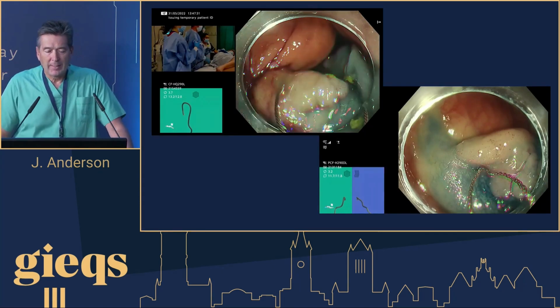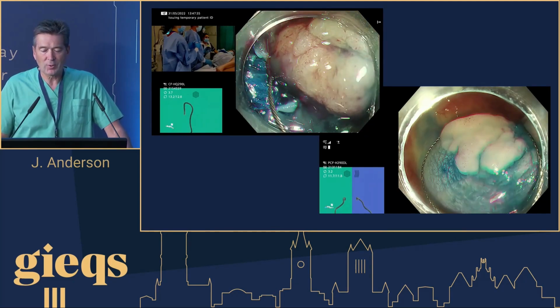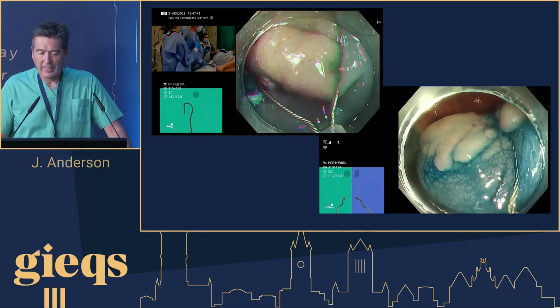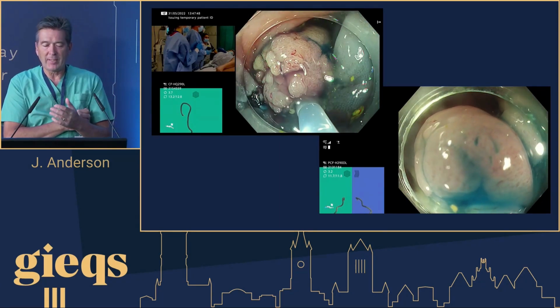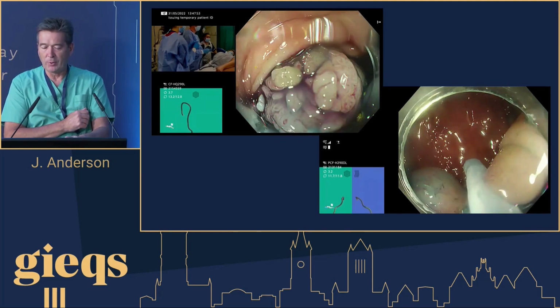And here's just a couple of examples of this. We want to be nice and close. We want a cuff of normal tissue. We push down. And after we close the snare, having pushed down to get the snare down, you're going to lift the tip up ever so slightly to make sure that the snare is in alignment with the muscle plane before you cut through.